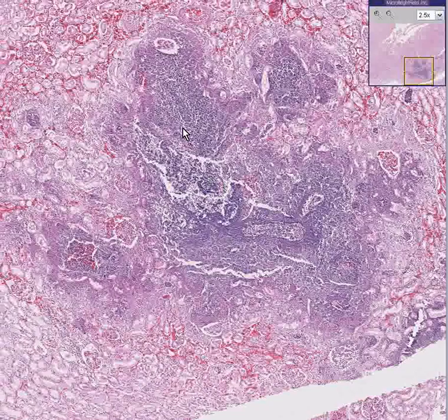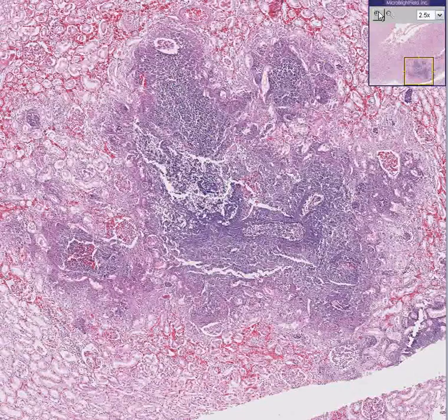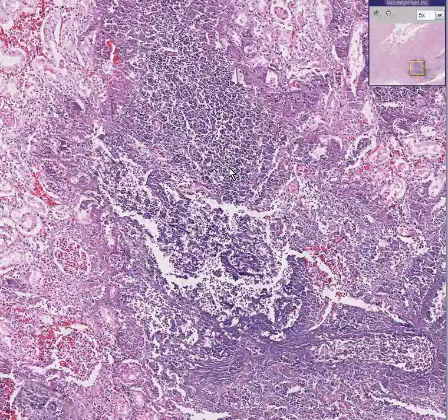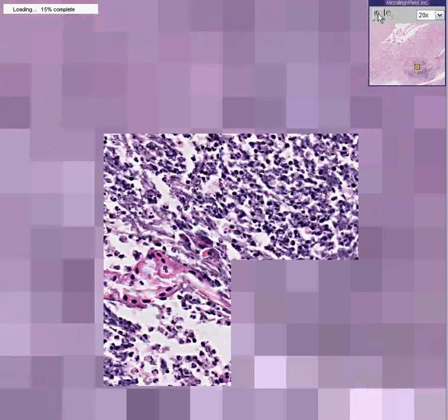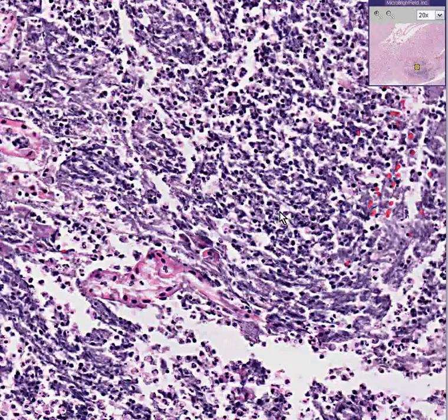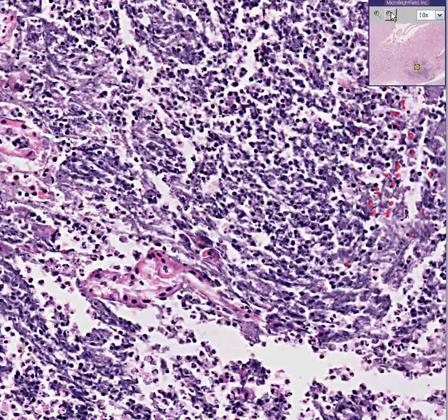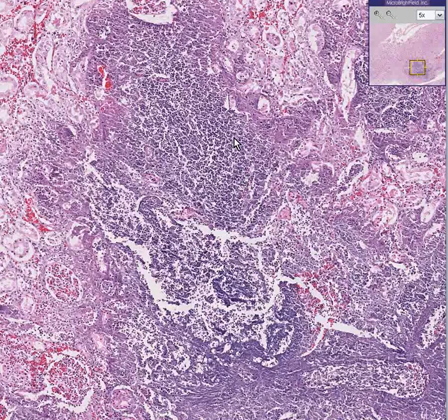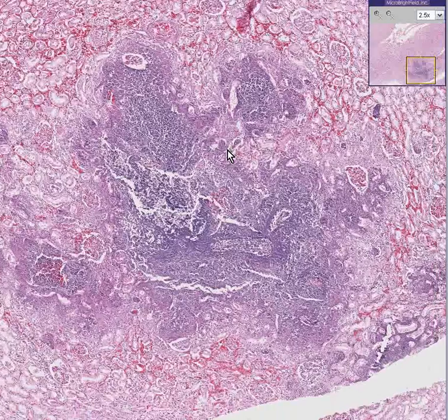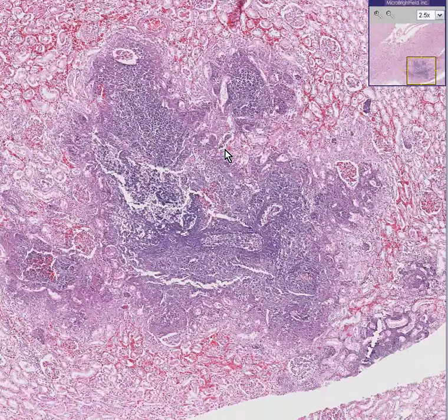So let's look at it. Why is it big and blue and dark and irregular? It doesn't take very long of zooming in before you could see it's irregular because it's loaded with neutrophils. So instantly you know that a well-defined collection of neutrophils in any organ, kidney or not, is an abscess. This is a renal abscess.